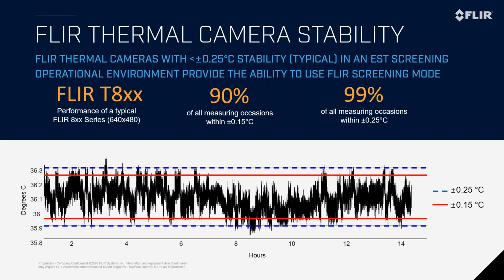And so what we do with our cameras is we point the camera at the black body. Let's say that's 100 degrees. And then the camera says, hey, I'm seeing this as 100 degrees. We go, okay, good, because you should see that as 100 degrees. Then we point at the one that's 500 degrees. And the camera says, hey, I'm reading something over here that's 500 degrees. And we say, perfect, you should be reading 500 degrees because when I plug this thing into the wall, it heats up to 500 degrees.